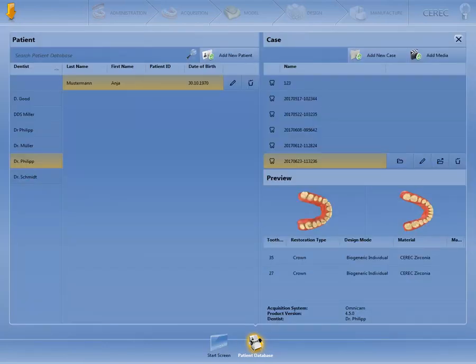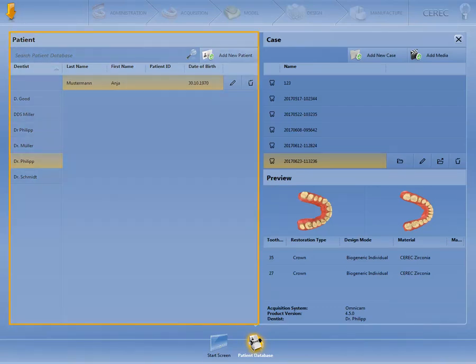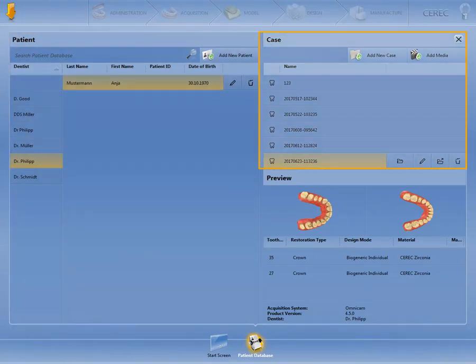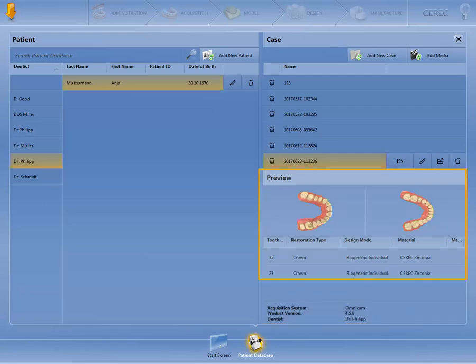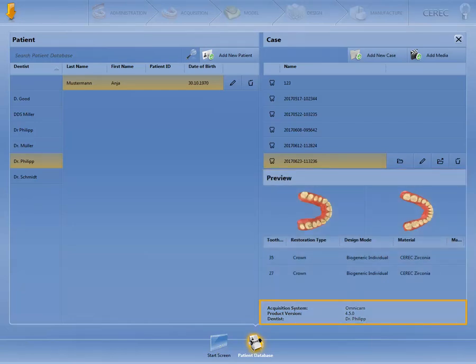This page is divided into three different areas: the patient area, the case area, and the preview area. The last one shows the preview, the design data for the case, information on the software version used, the acquisition system, as well as the name of the dentist.